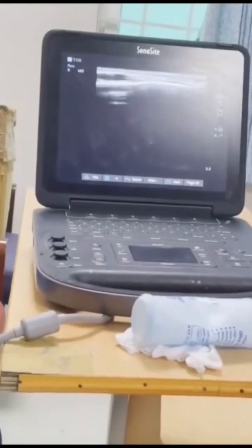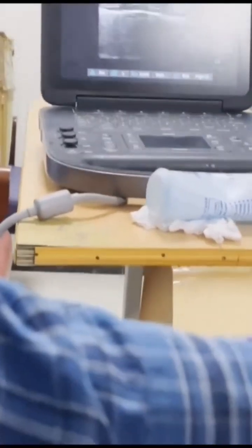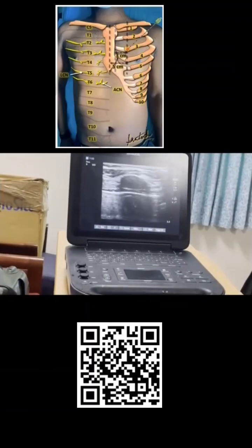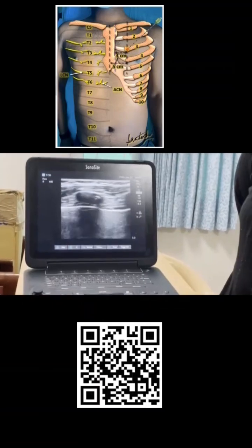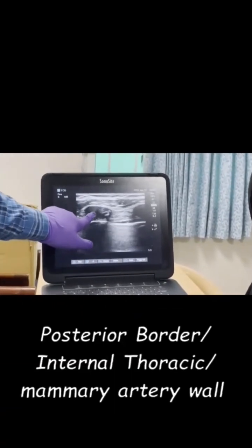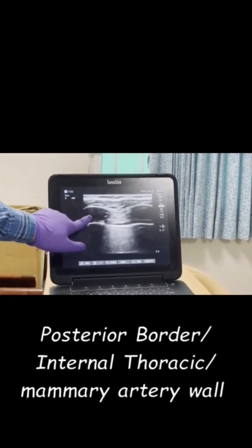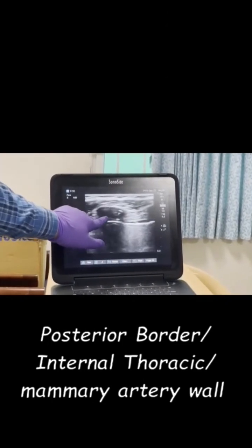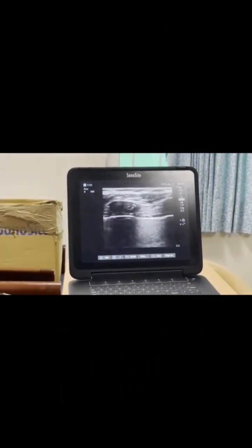Now, if I go laterally, just follow this. When you see an anechoic or hypoechoic elliptical structure coming — that is not the rib, these are the cartilages. The typicality of the cartilage is you can see it as hypoechoic or anechoic structures where you can see the posterior border also and the pleura also.